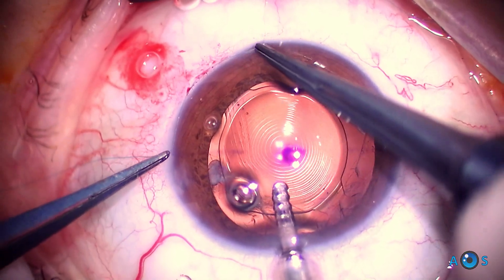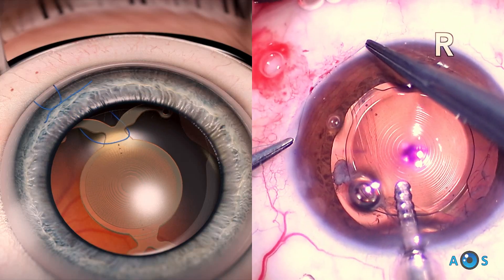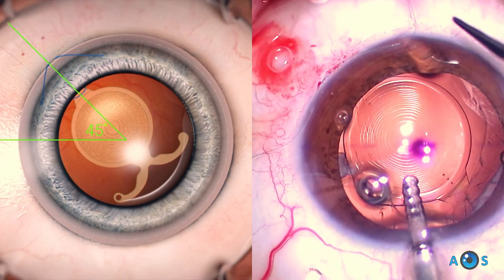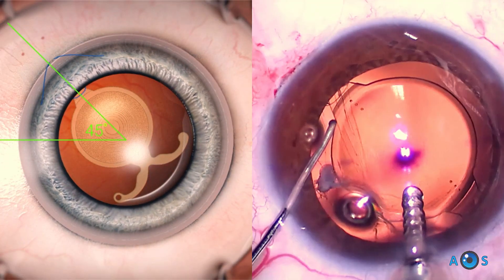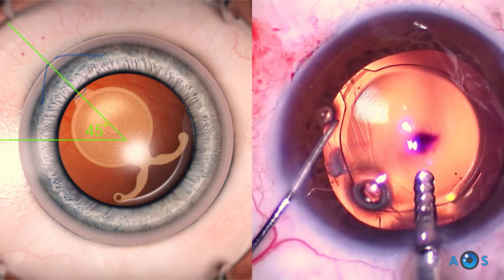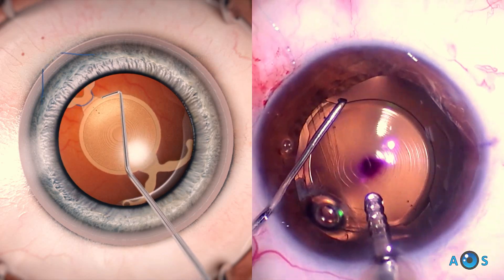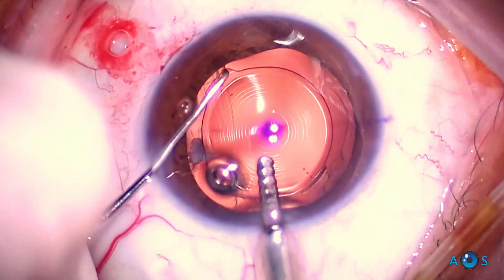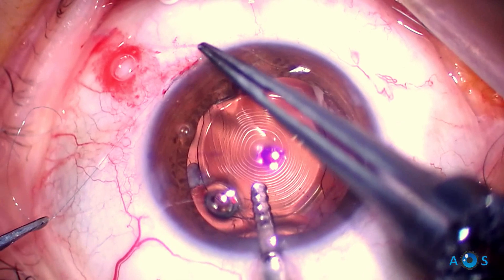Continuous irrigation stabilizes the anterior chamber, and vitrectomy helps to clean residual opacities. The first knot is completed and the IOL is within the axis; however, it is out of center. A chopper hook works to bring it back to the central cornea.